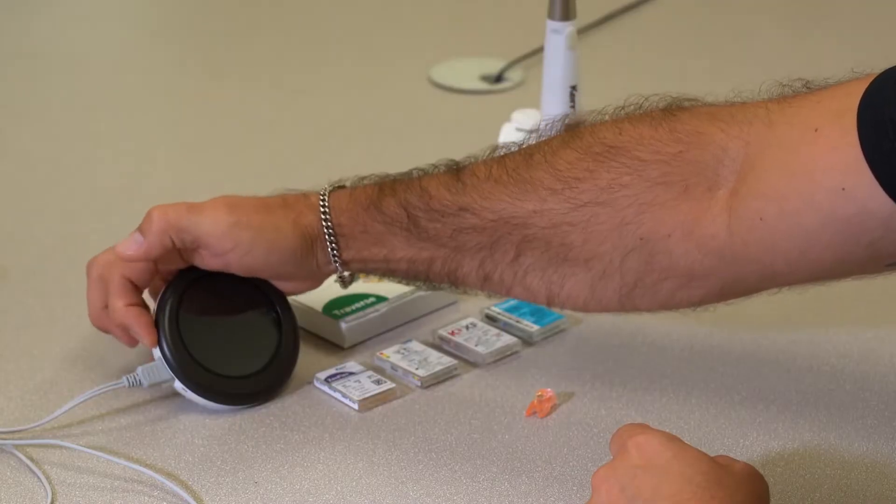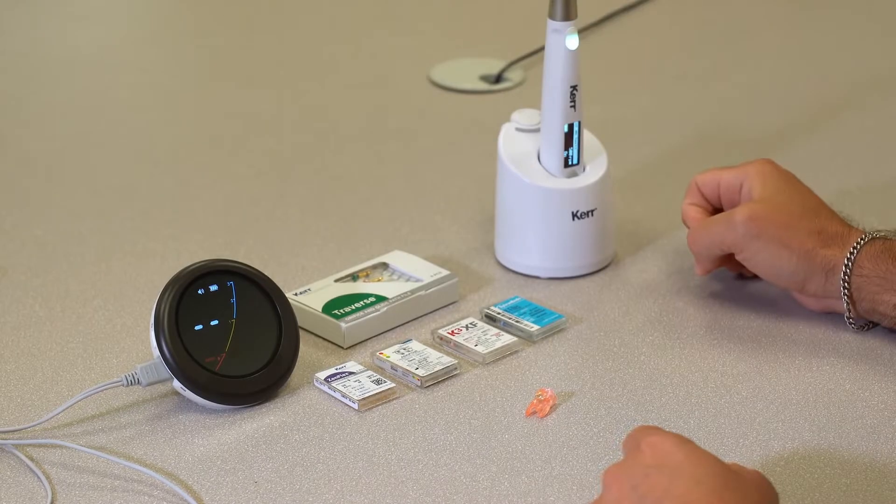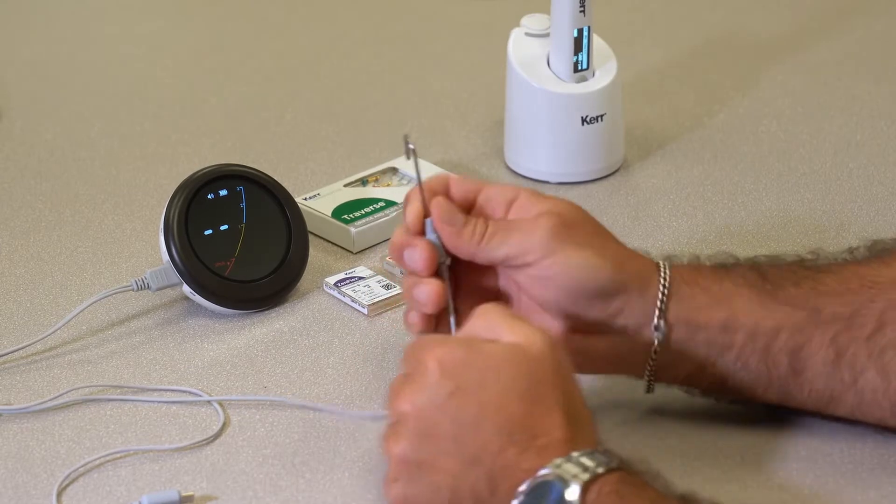I'm going to show you how the Apex Connect and the Elements Connect can be connected in conjunction with each other so that you can do real-time Apex location while you're shaping with your Ni-Ti instruments. We're going to turn both units on. On your Apex locator you're going to take your lip hook and insert it into the round side just like you normally would.